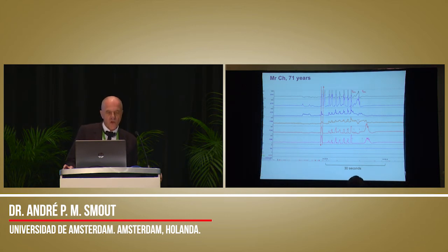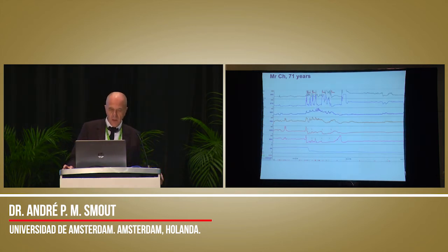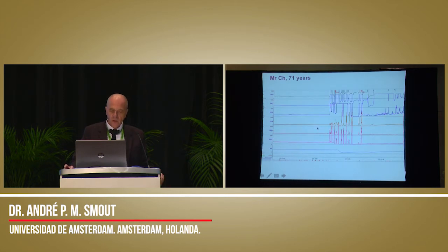characteristics of the supragastric belch. You see air going in and going out immediately thereafter, and it is called supragastric belching. This is another example where the supragastric belching occurs during or at the onset of a reflux episode, and this is another example where he shows the same phenomenon.